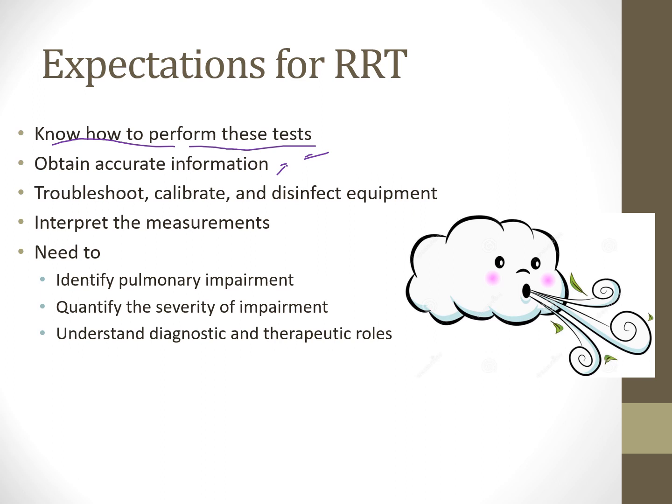We also, since we're the ones usually performing the test, are responsible for troubleshooting, calibrating, and disinfecting the equipment. The last thing you want is someone with already compromised lung issues to get a pulmonary infection, right? So disinfecting would be a big thing. Making sure the equipment is calibrated and appropriate for that patient is important. And in fact, you have to do that every day someone tests. And then troubleshooting. What if there's a leak in the system when you're doing the carbon monoxide testing, right? So we have to make sure we go through those things.